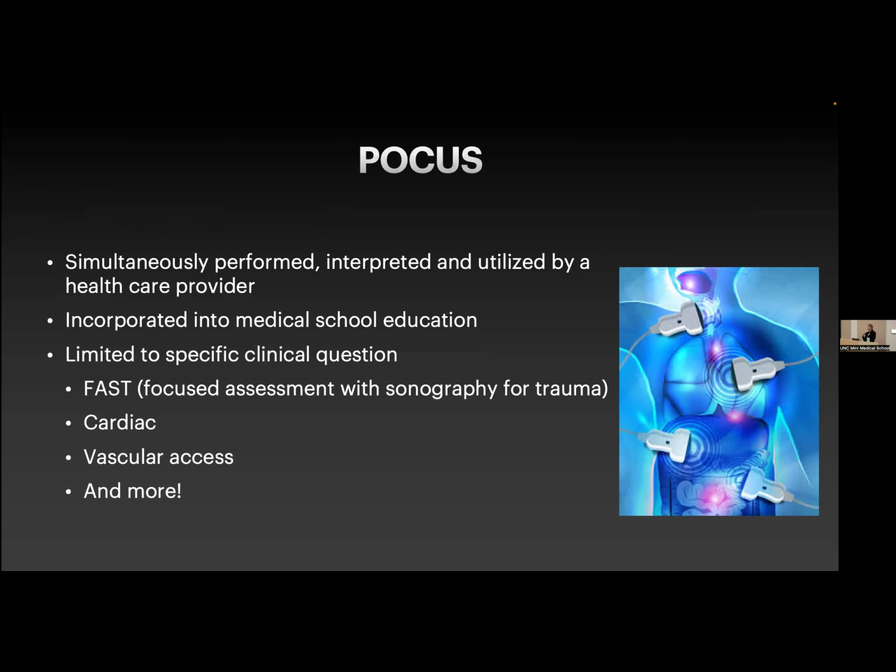You can put an ultrasound probe on and we can show examples of the heart and see, oh, there's fluid there. Maybe it needs to be drained so the patient will feel better. Or maybe we can see if it's infected. Need to put a line in, like a vascular access. We can do that and so much more with point of care ultrasound.